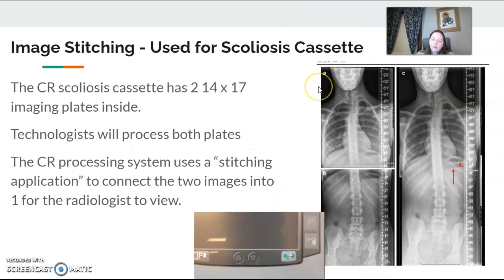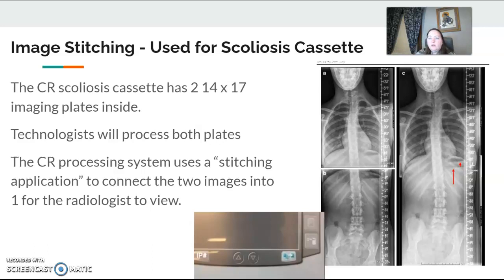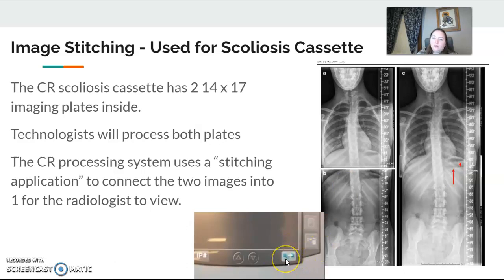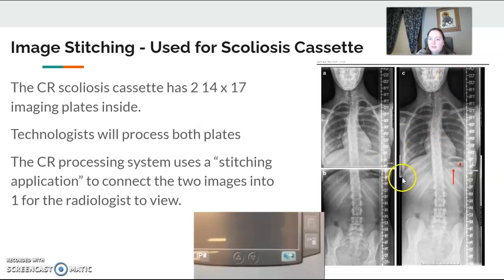Stitching is used for the scoliosis machine. Our CR scoliosis cassette has two 14x17 plates inside it. The technologist makes the exposure in the room, then has to process both plates — process one, swing the cassette around, and process the other. It'll look like a top and bottom separated. Once you process the second image, a stitching button will appear on our Fuji CR — it has three little pictures combining into one. Once you click it, it combines the two pictures into one to send to the radiologist. As long as you didn't collimate off the sensors on the sides, it does this automatically; otherwise you have to do it manually.